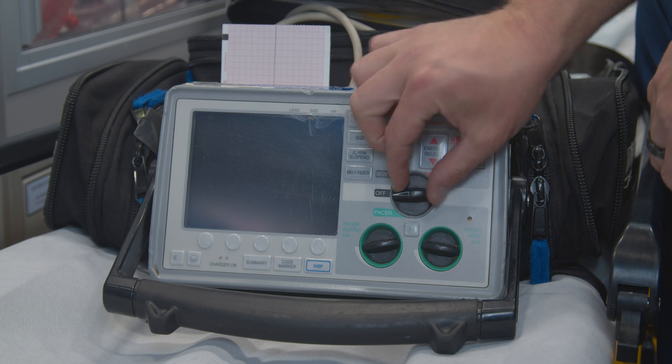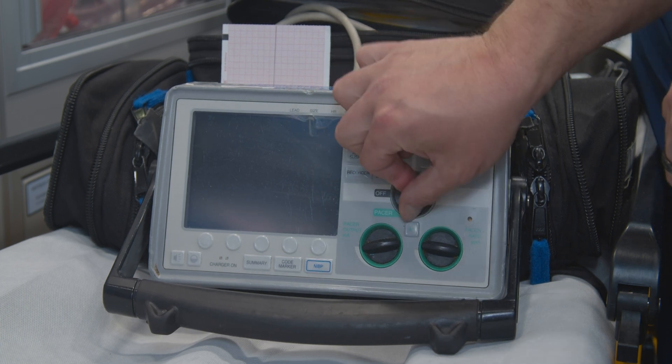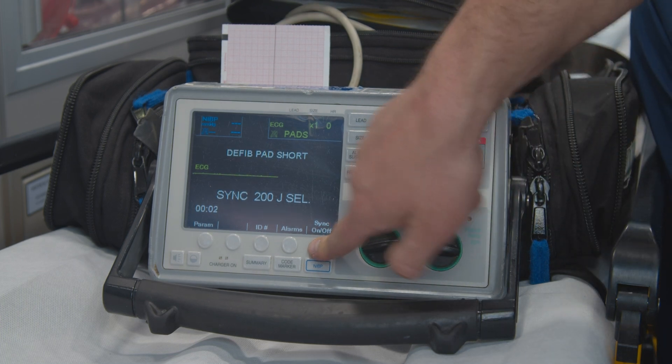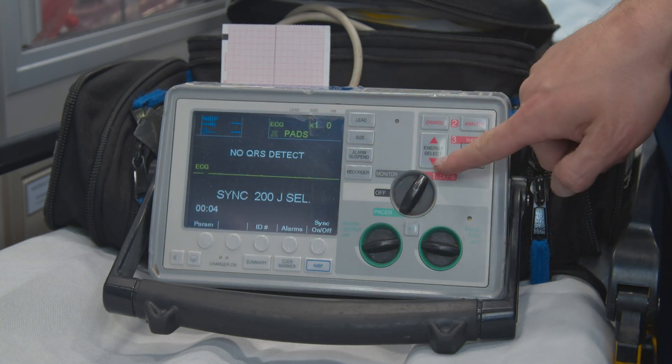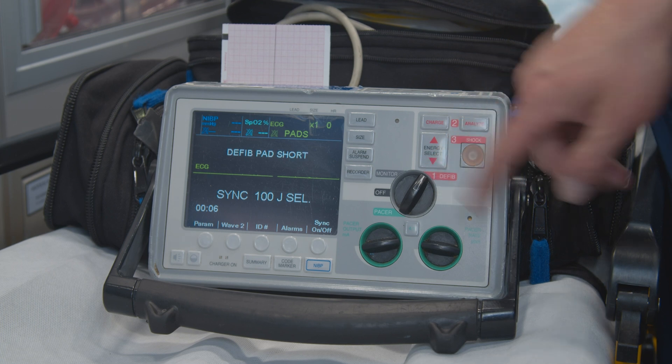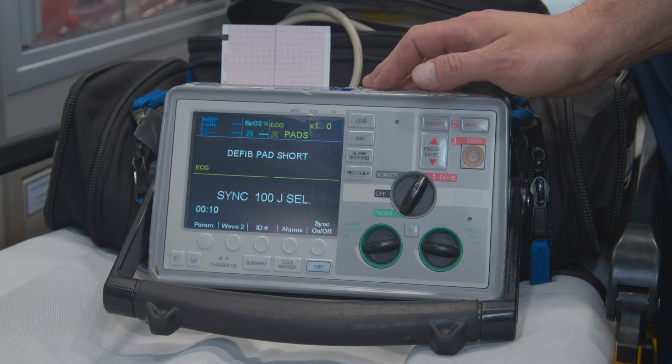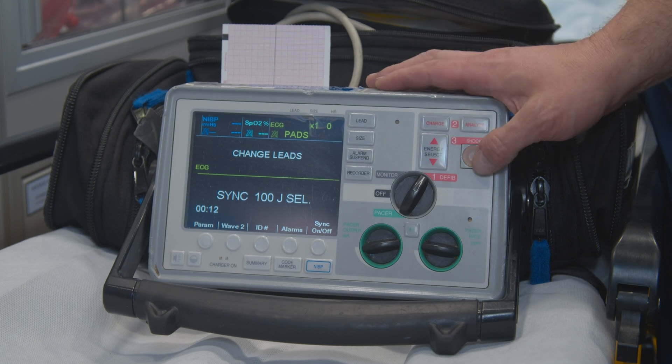Going back to defib — you can hit sync. Now you've got sync and you can do your synchronized cardioversion. Change it to the joules that you want, and again, charge up and defibrillate.